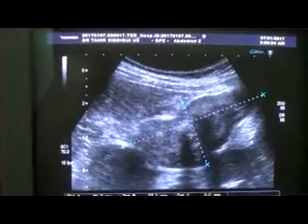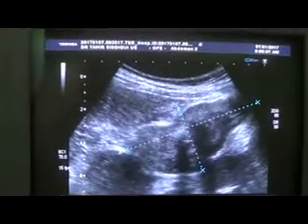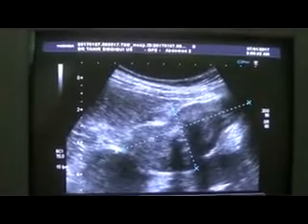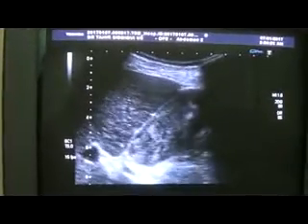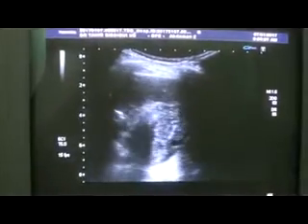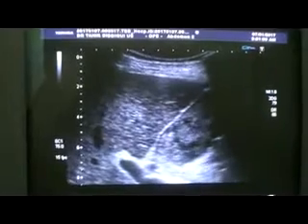This is the calculus, and this is all sludge within the gallbladder, filling all of the lumen. Here you see another view of the same. You can see different strength echoes, and the dark shadow is from the calculi within it.